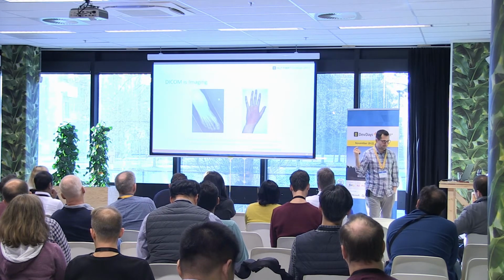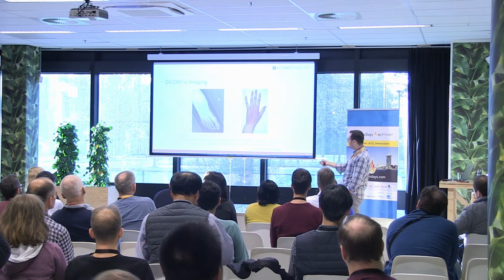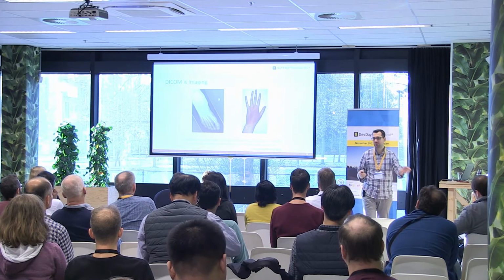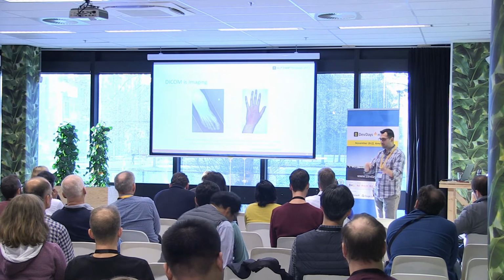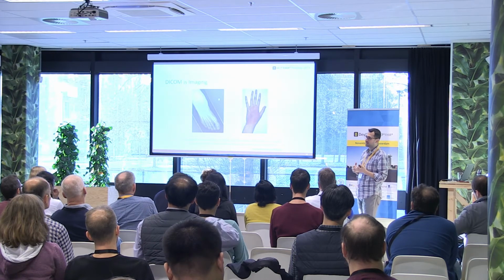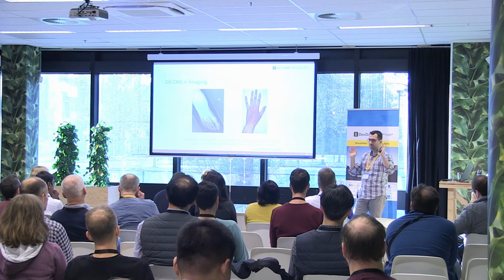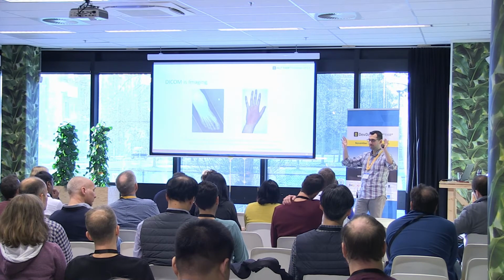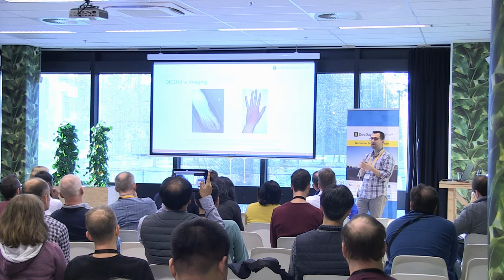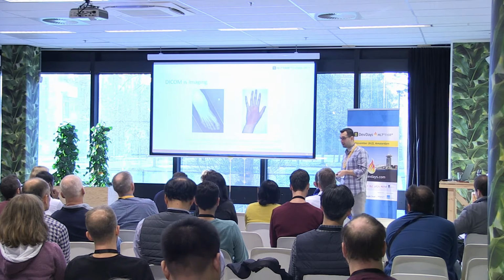This is where you go into DICOM. So DICOM is a standard for handling, storing, printing, transmitting information. There's actually more to it, but this is just kind of scratching the surface. So DICOM is not just, here's an image, we captured it in DICOM, put it somewhere, forget about it. There's a lot more to DICOM. DICOM handles how images are stored, how they can be transmitted, and then when you have multiple copies of images, if something happens to any of these copies, like an update happens, how do you reconcile all that information? Make sure that everybody is on the same page. So there's a ton more to DICOM than what most people think about.